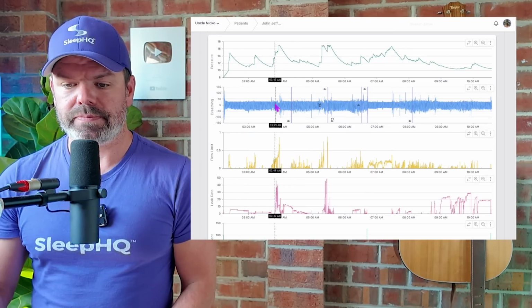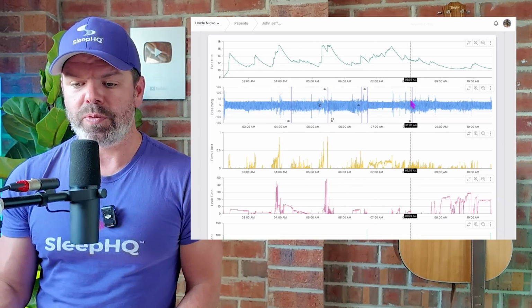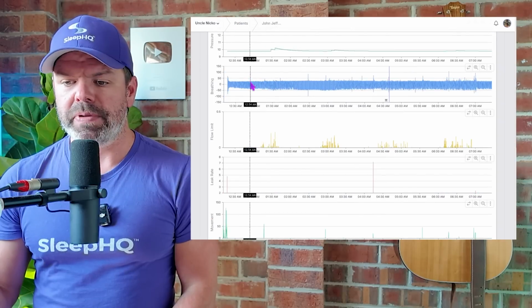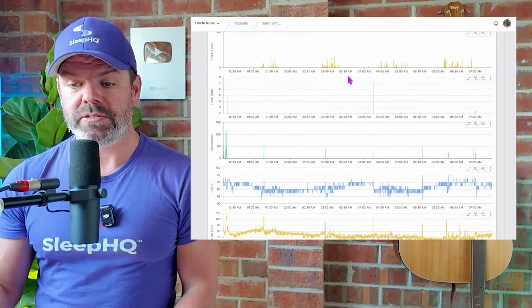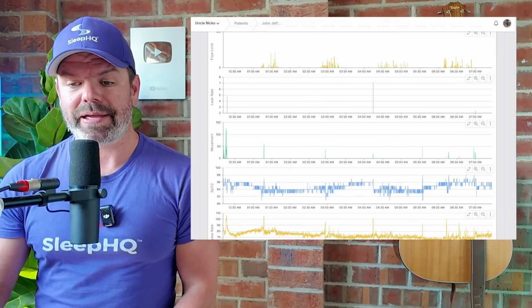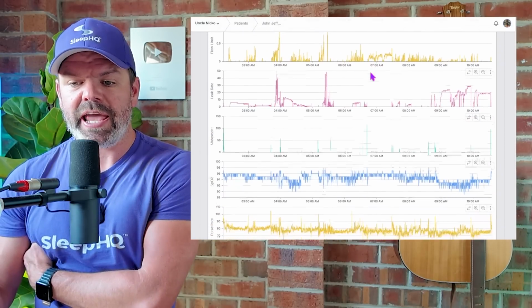All right, look previously at the breathing. See, there's all these big jumps here, narrow sections, big jumps everywhere. The breathing's very irregular. Now it's Mickey Mouse. Coming down further, look at the airflow limitation. Only a few little sections associated with REM sleep. Come back again. Look at all the airflow limitation. Check out the leak here.